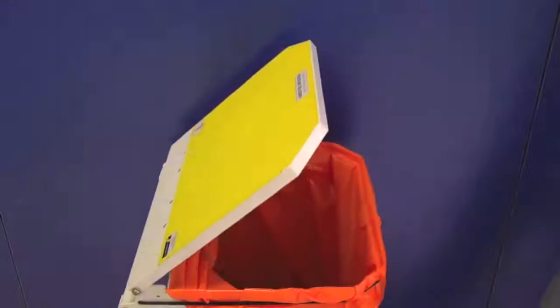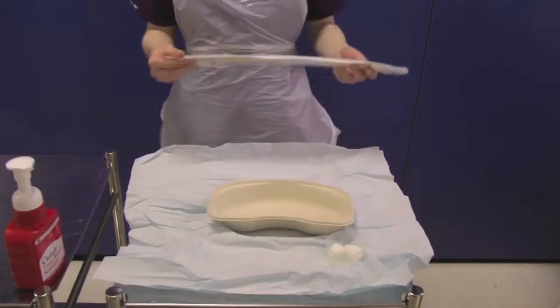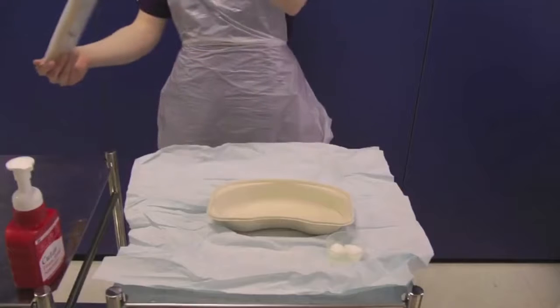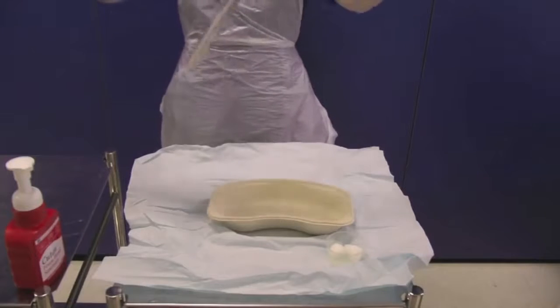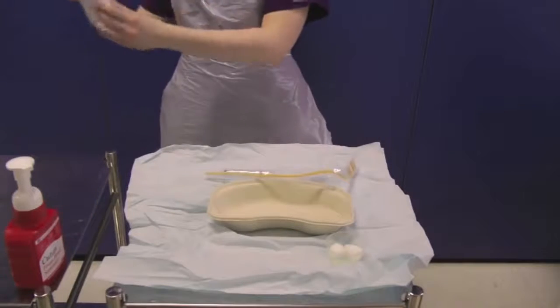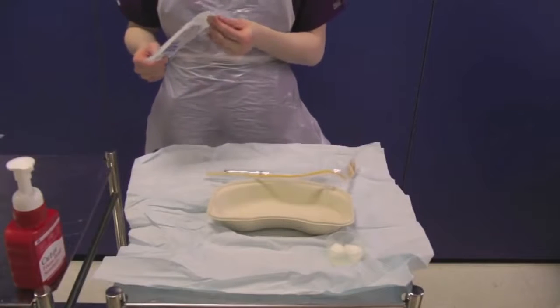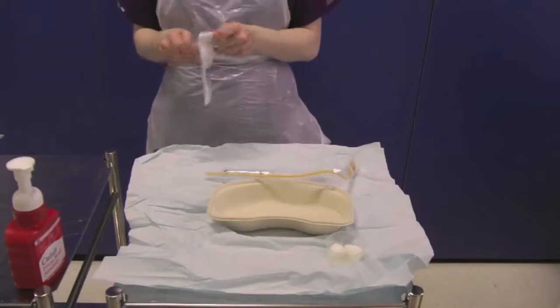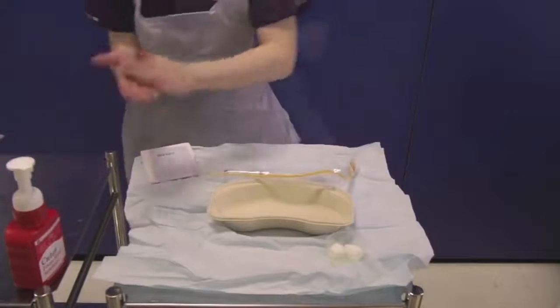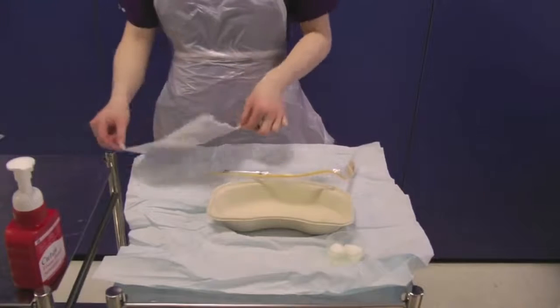Remove your gloves and decontaminate your hands. Take the selected catheter, ensuring you have the correct size. Check the expiry date and note the stickers on the catheter pack that must be saved for use in the notes later. You can use both a standard size and a female size catheter in women. Open the outer packaging and carefully drop the catheter and syringe onto the sterile field. Be very careful not to touch the sterile field with the non-sterile outer catheter packaging. Open the outer packaging of a pair of sterile gloves, drop the internal packet onto the sterile field, decontaminate your hands, carefully open the sterile wrapping ensuring you do not touch the sterile field, and put the gloves on.